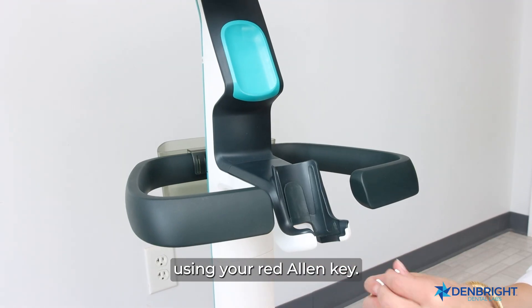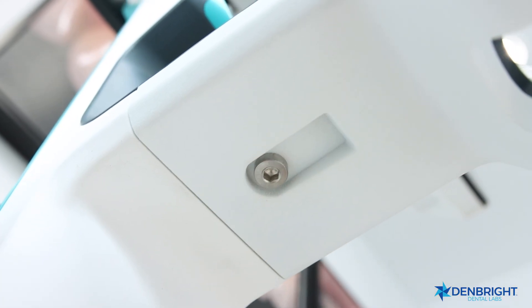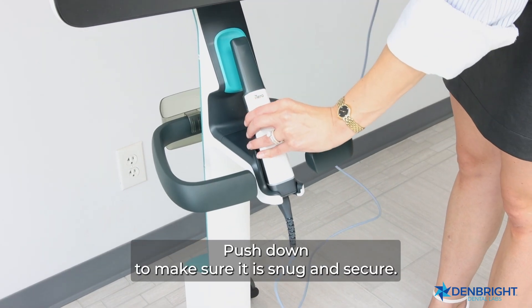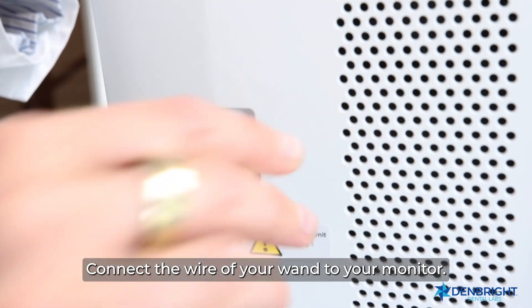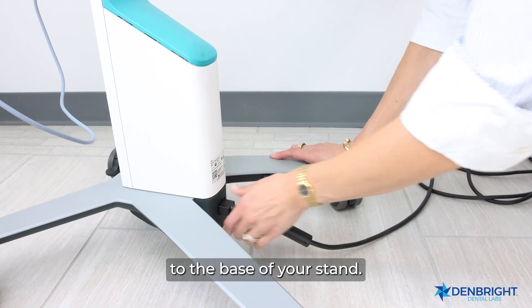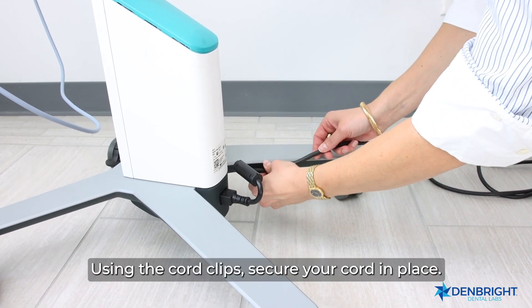Insert and secure your cradle using your red Allen key. Insert the base of your wand into your cradle and push down to make sure it is snug and secure. Connect the wire of your wand to your monitor, then connect your power cable to the base of your stand. Using the cord clips, secure your cord in place.